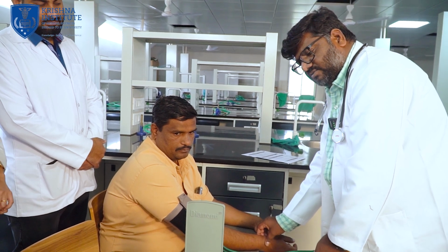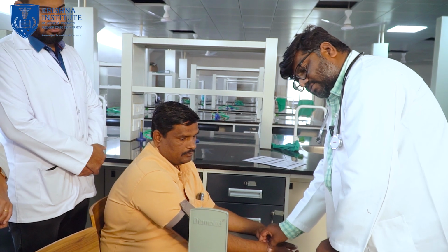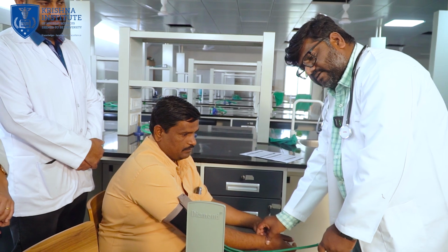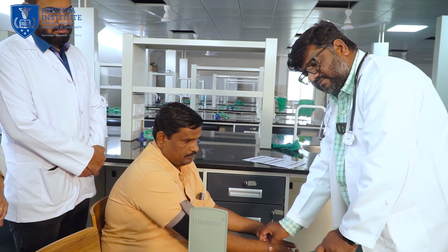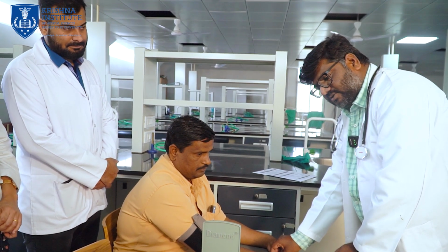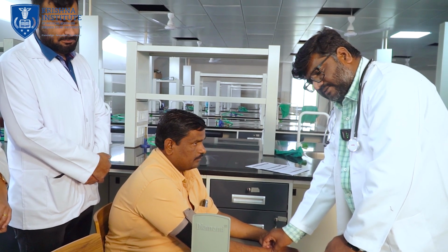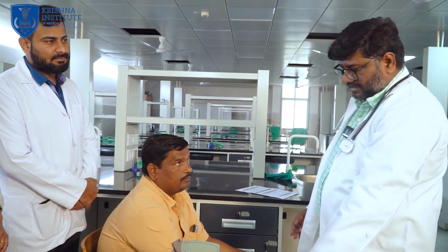Inflate the cuff till the pulsation of the radial pulse vanishes. Then slowly deflate the cuff, and note the blood pressure on the sphygmomanometer where you palpate the pulse. Note that this is your systolic blood pressure, and you have confirmed this by palpatory method. Then completely deflate the cuff.